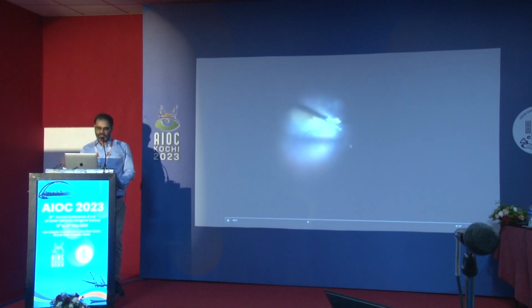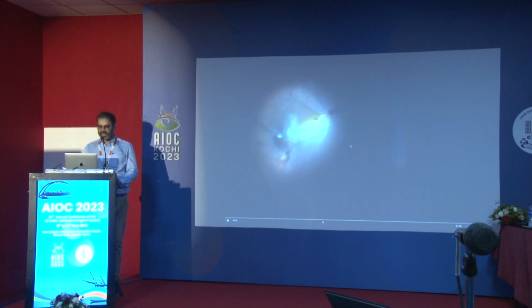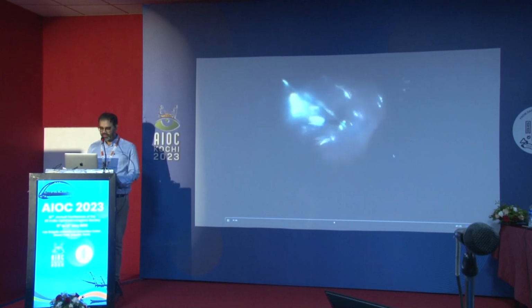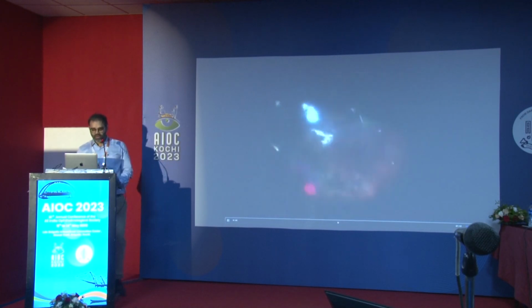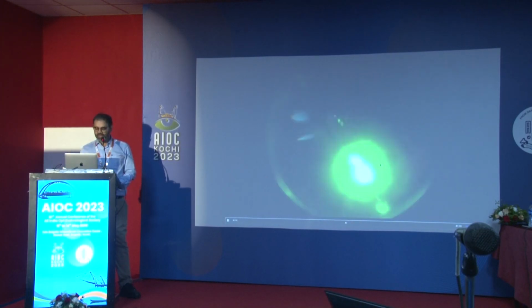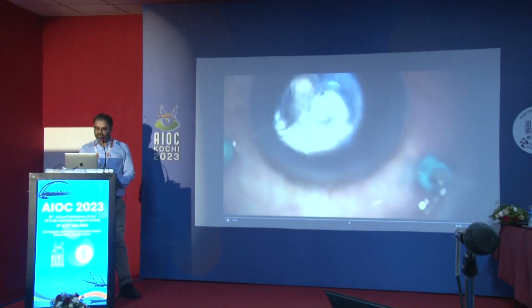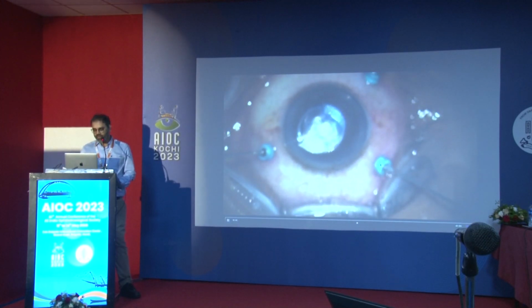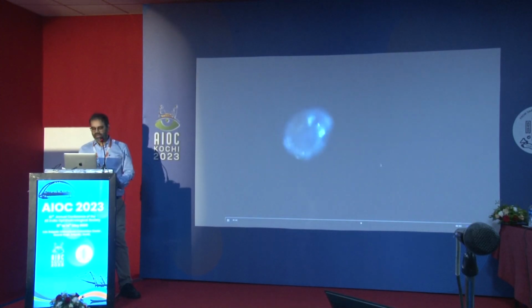I didn't go in for taking a retinal graft here, because I was scared that it may induce more PVR changes. So in this case, we tried to remove ILM as much as possible, and then we did a fluid-air exchange, followed by a maneuver reducing the size of the hole. And here we have used the corneal epithelium as a scaffold over the macular hole so that it prevents redetachment. We have sent this for review, and it is under review for publication.